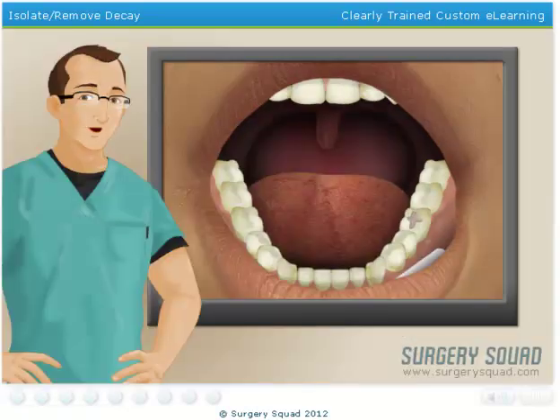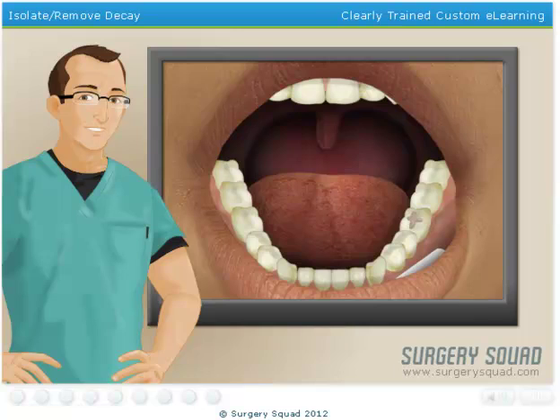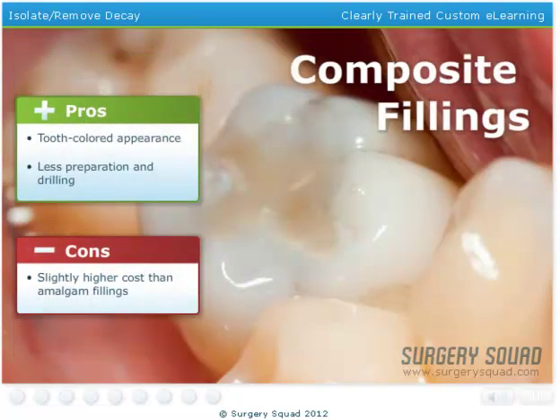Now that the decay has been removed, we need to figure out which type of filling our patient wants: amalgam or composite. Both have their advantages and disadvantages. Amalgam fillings are more durable than composite, but they don't have a tooth-colored appearance like composite fillings, and they often require a larger portion of the tooth to be prepared to retain the filling. Composite fillings are much more aesthetically pleasing and require less drilling than amalgam, but they can be a bit more expensive.